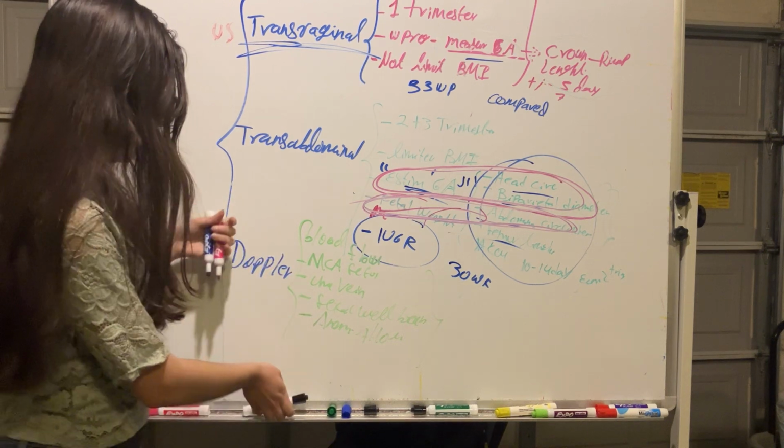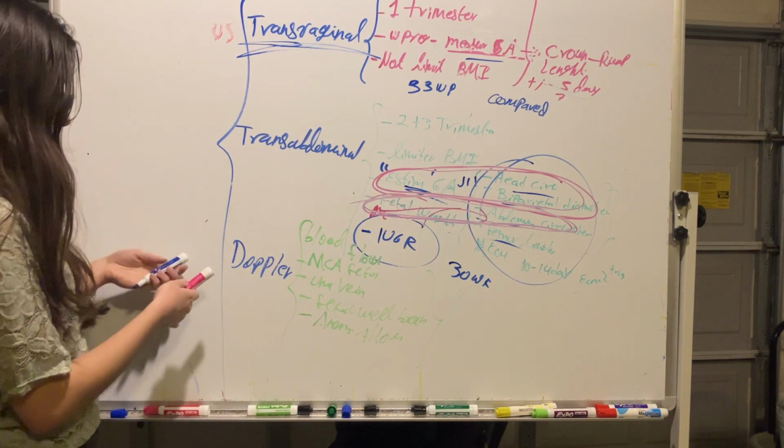And so, what are the indications for ultrasound?